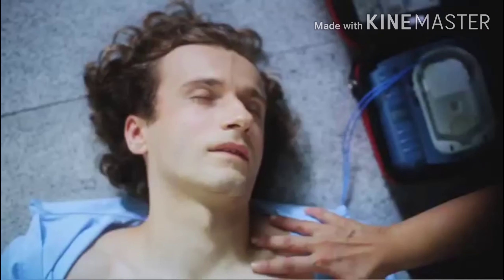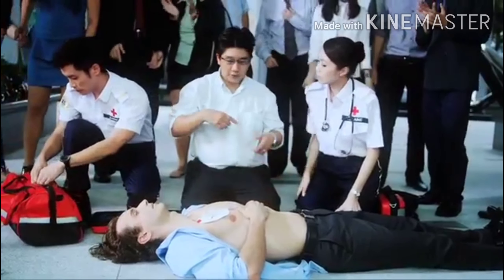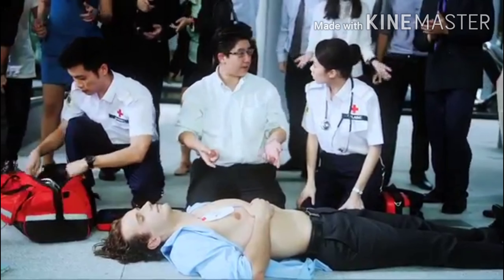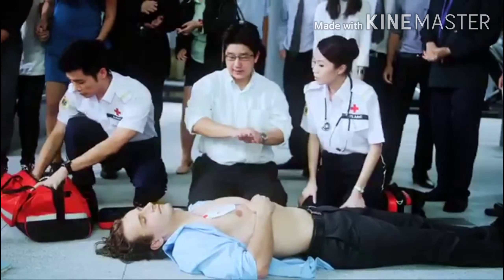Sir, are you okay? What happened? We found him collapsed, so we did CPR and I gave him one shock from the AED. Now he's back. Okay, I'll take over. Good job.